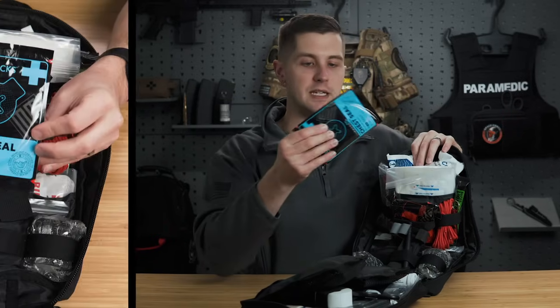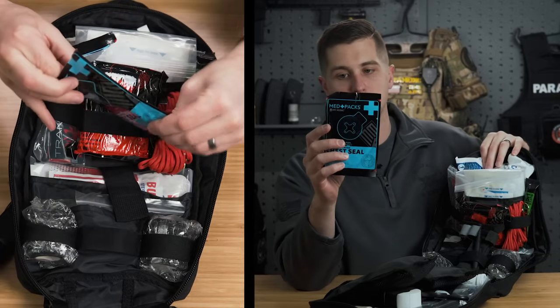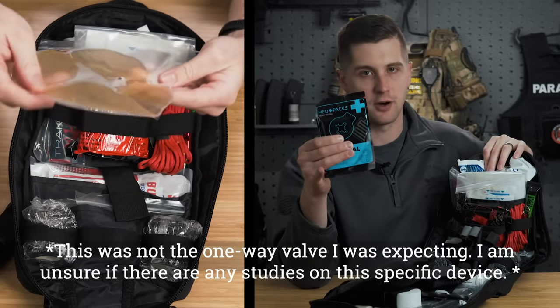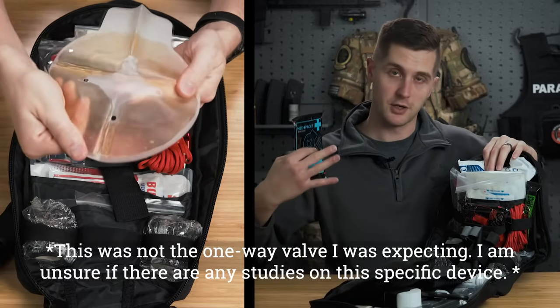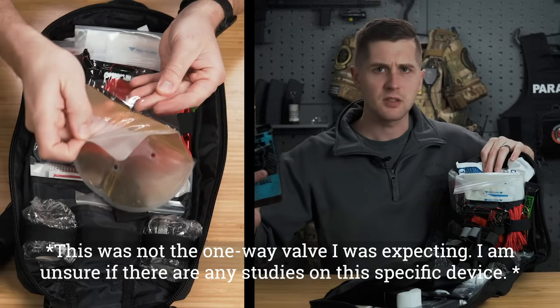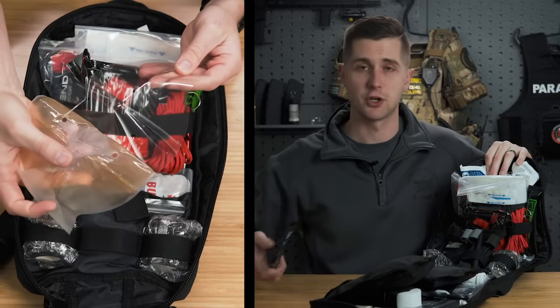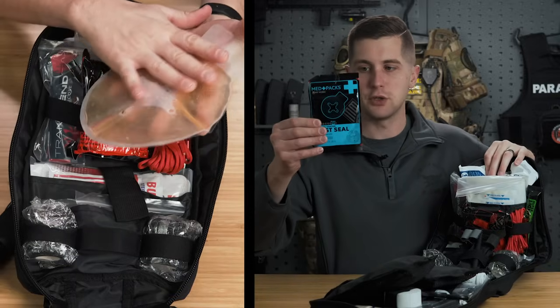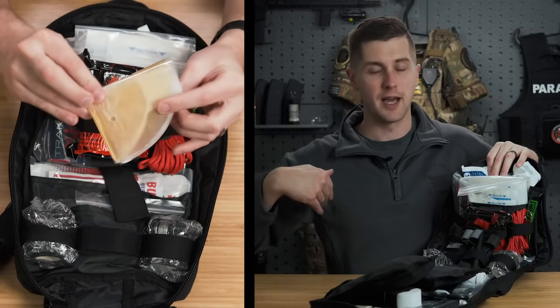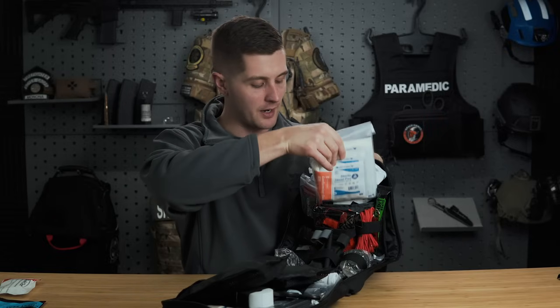We have a chest seal. So this is their own branded chest seal. It's got the one-way valves on it, which are fine. There have been some studies that have found that with this one-way valve, they get clogged if it's severe blood loss. So if you have a hemopneumo, these can become clogged. Not a huge deal. You just monitor them for a tension pneumothorax and you can burp the seal if they start showing signs of that. So they do have the chest seal in here, and this only has one seal in it. So if you have an entrance and exit wound, that is something you might have to address by other means.